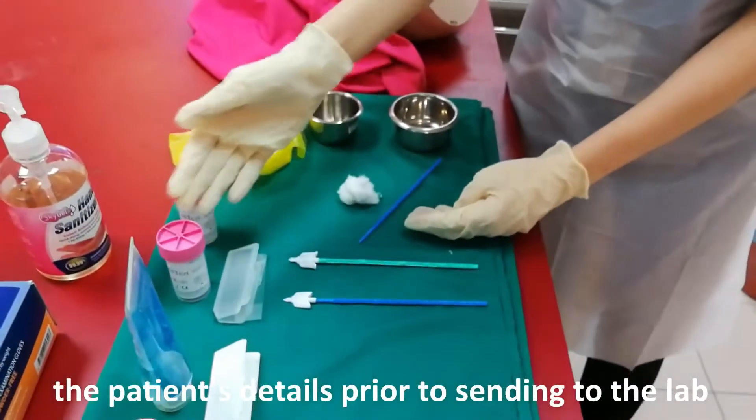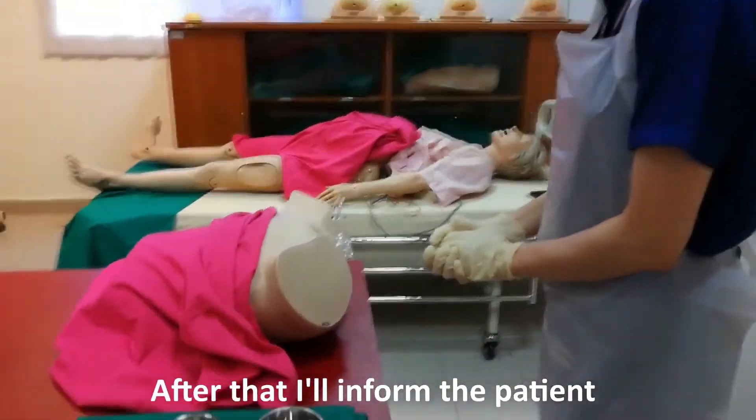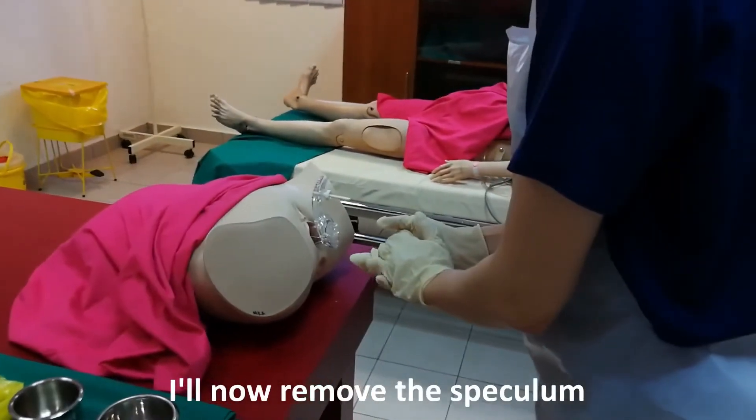Be sure to document the patient's details prior to sending to the lab for investigation. After that, I'll inform the patient that the procedure is complete. Madam, we are done with the procedure. I'll now remove the speculum.